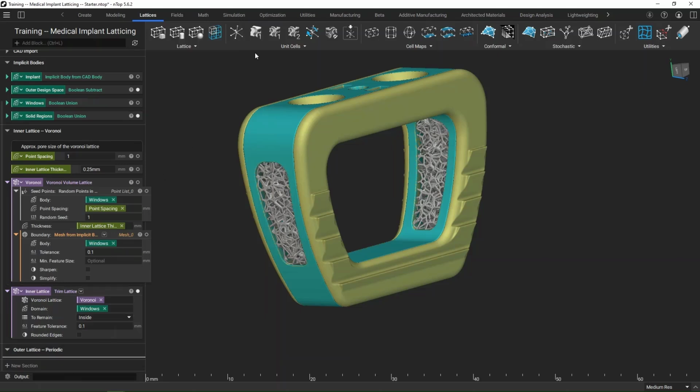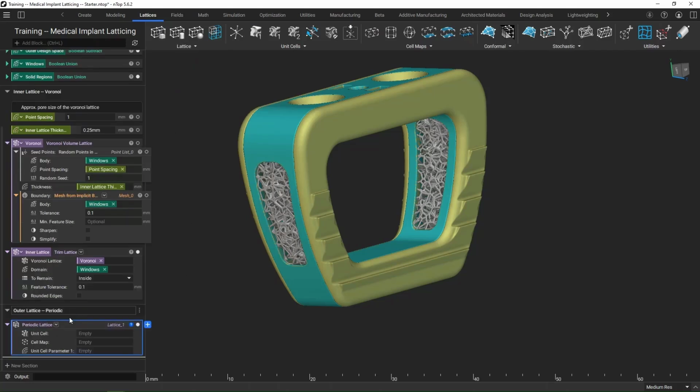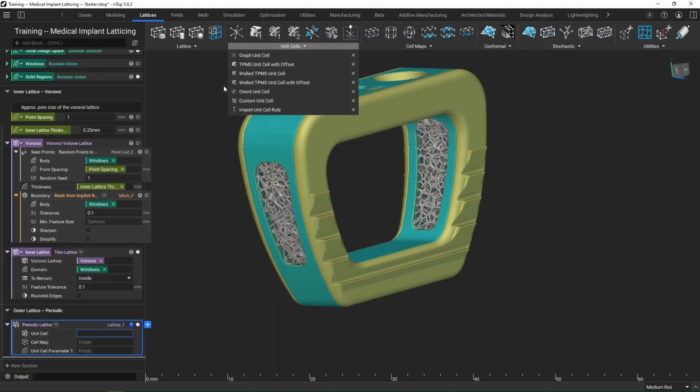And then if I go back up to my ribbon, we have our different latticing types. I'm just going to go with that periodic lattice. And it's asking for a few different things now. So first up is that unit cell. I could do that double click method. I can also see them up here to have a bit more visual of what I'm looking for. Maybe we want to fill it with a surface-based continuous lattice, so maybe a TPMS structure, could toss a gyroid in there. But I'm going to go ahead and just use a graph unit cell instead.